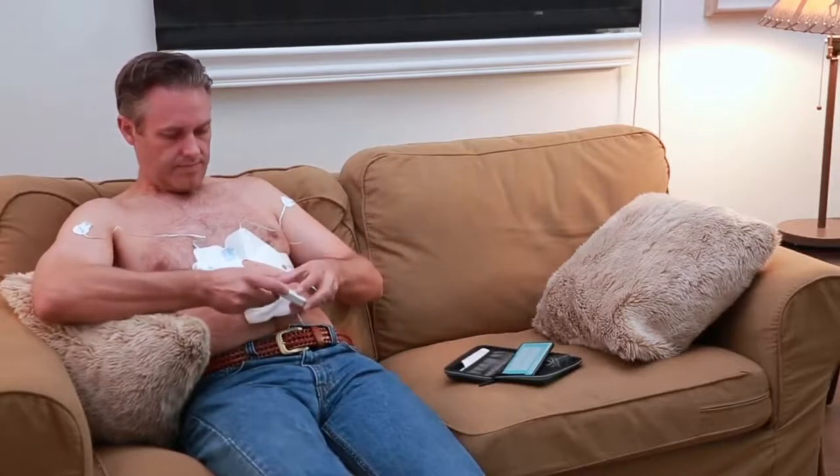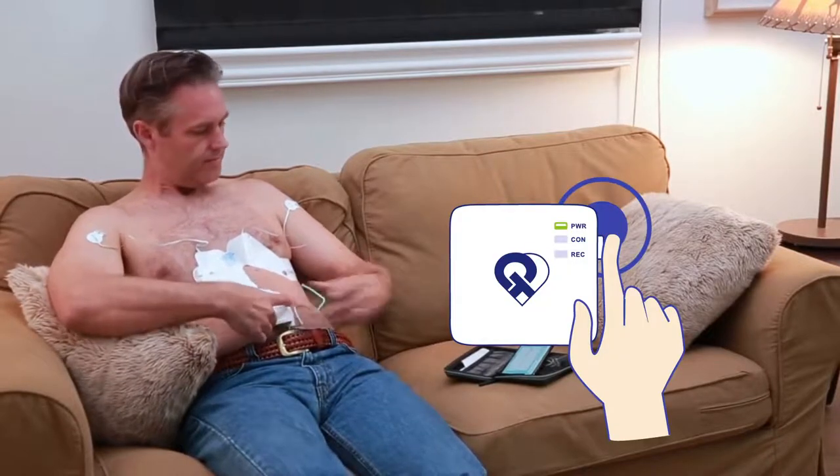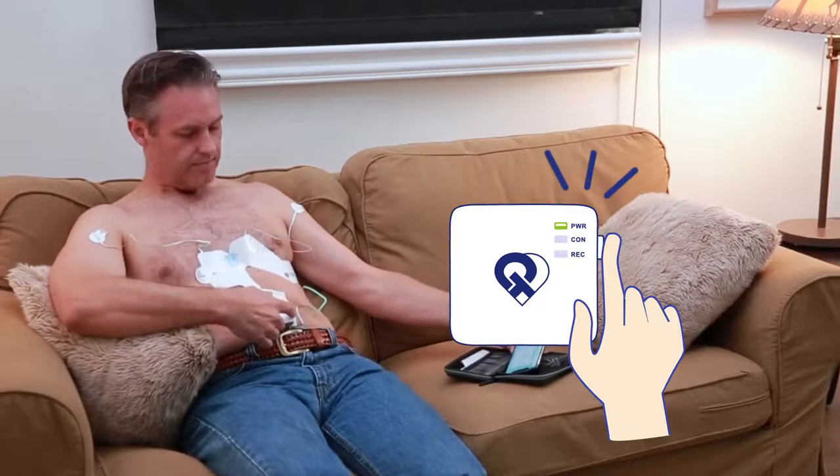Place the piece of gauze provided between the recorder and your skin. Connect the recorder to the electrode strip. Turn on the PCA 500 recorder by holding the power button until the lights on the front begin to flash.